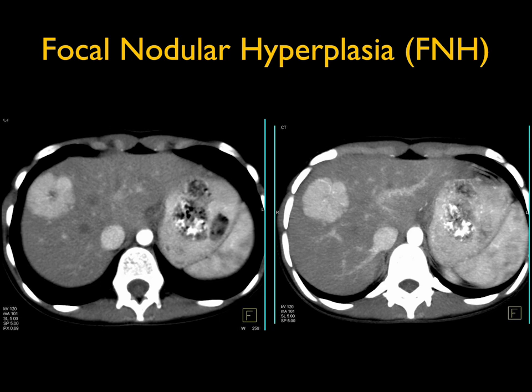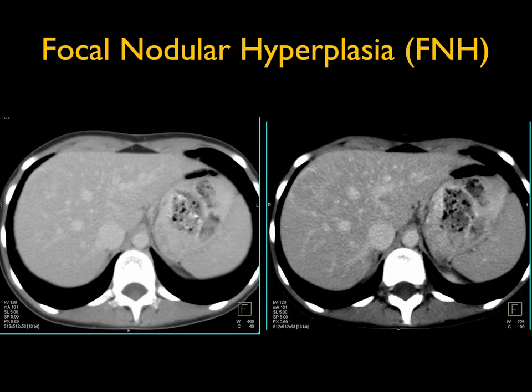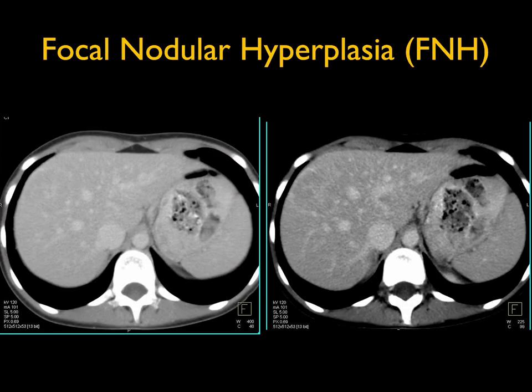A central scar is more common in focal nodular hyperplasia than in metastasis. These lesions also wash out — at about 60 to 80 seconds the lesion is almost totally gone, nearly isodense, and that is the classic appearance of FNH. On MIP imaging you can often see a feeding vessel going to the central scar, and then fairly quickly the lesion becomes isodense and nearly non-visible — consistent with focal nodular hyperplasia.